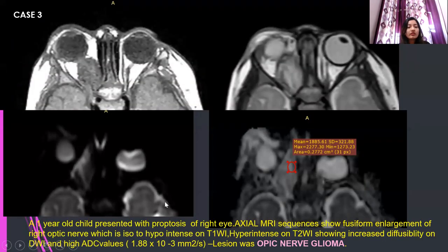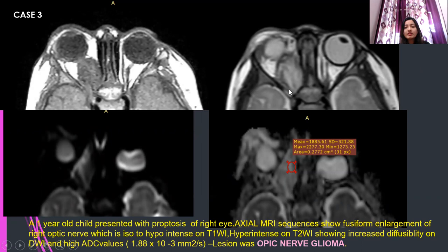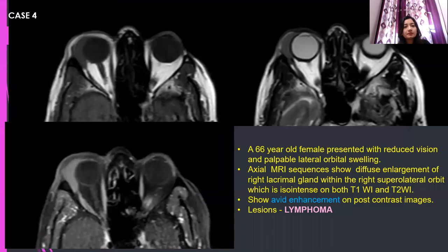Case 3: a 4-year-old child presented with proptosis of the right eye. Axial MR sequences show fusiform enlargement of the right optic nerve, which is isointense on T1 and hyperintense on T2, showing increased diffusibility and high ADC value with a mean of 1.88 × 10⁻³ mm²/s. The lesion was an optic nerve glioma.